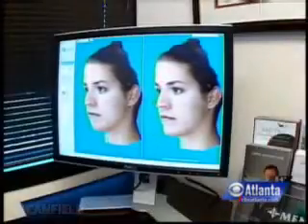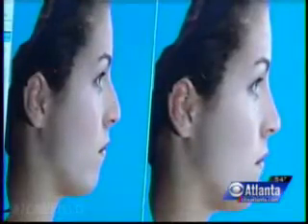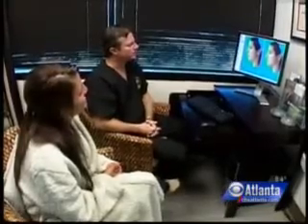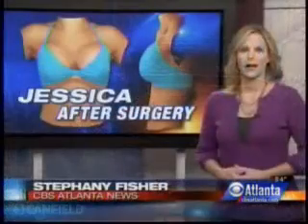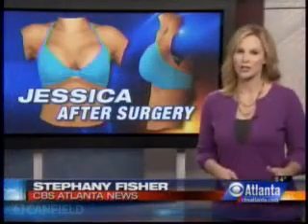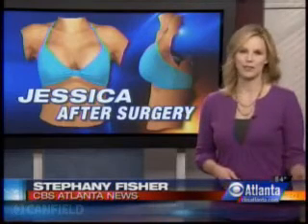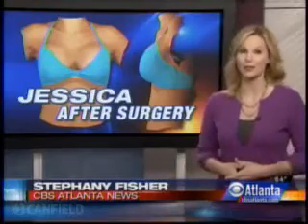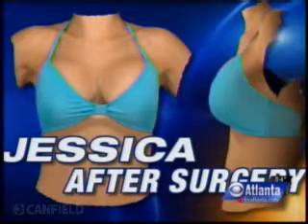It may be reassuring, but Connors says patients still need to be realistic about their results. It's not just the computer generating a result, it's actually me artistically saying this is what I'd like to present to you as a potential result, and knowing full well that there are no guarantees. Dr. Connors says the Vectra does not replace a full physical examination and personal consultation with each patient. He still takes measurements and uses this only as an added tool to help the patient visualize and then fine-tune their results.